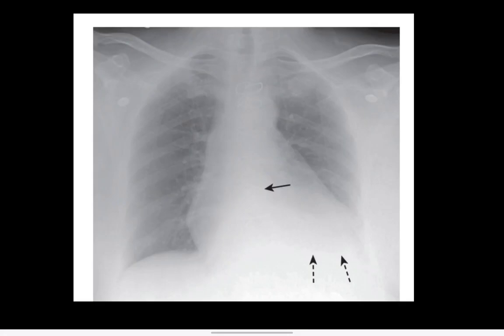Now time for a slide quiz regarding this image. Please specify the type of radiograph. Is it AP or PA? And specify the adequacy parameters. Is it underexposed, overexposed, or adequately exposed? 10 seconds to answer.